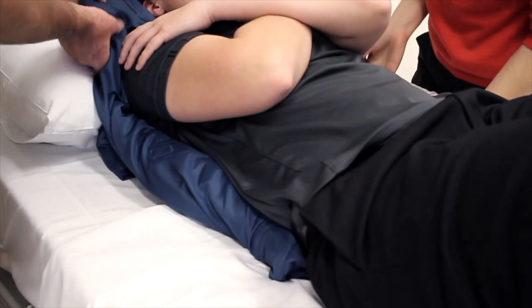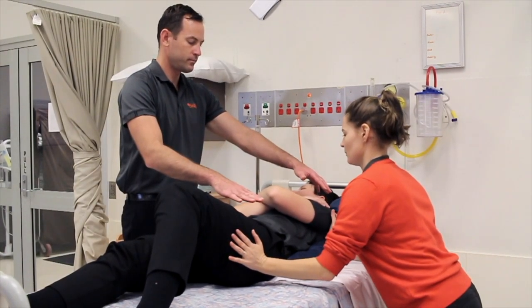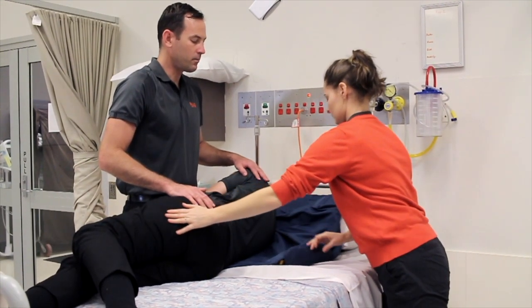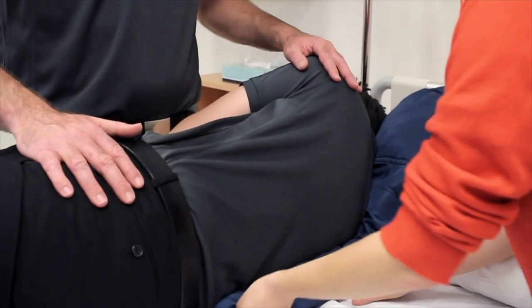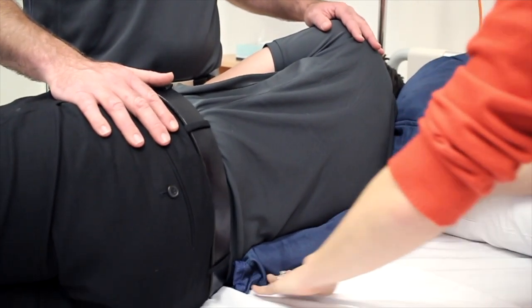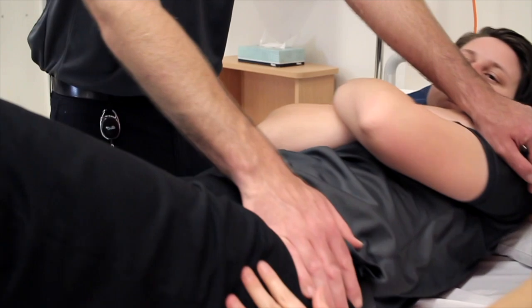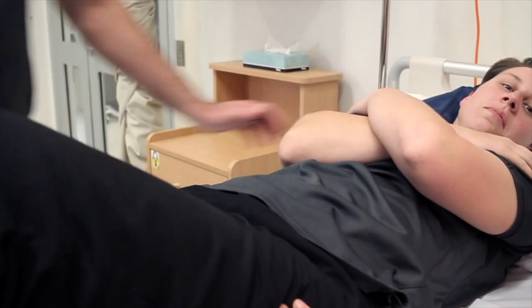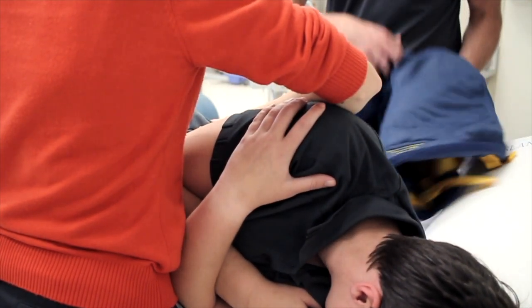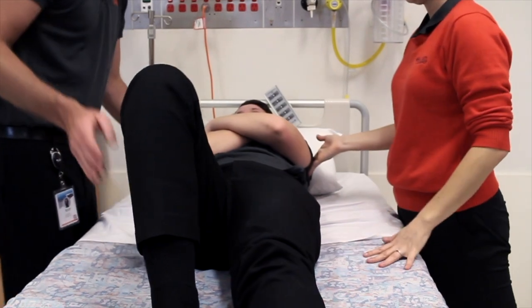We then position the resident or consumer in a rolling position with a pusher and a puller. The pusher will roll the resident towards the other colleague. We continue to roll the hoist sling underneath itself and tuck as able. We then tell the resident or consumer to roll back over, notifying them there'll be a little lump in their back as they roll over, and continue to roll until the sling is easy to remove. There should be no risk of skin tears or catching as the sling is rolled into itself rather than against the resident. Once the sling is removed, position the resident or consumer in the optimal position on the bed, looking after pressure care, comfort, dignity, and accessibility to any devices.